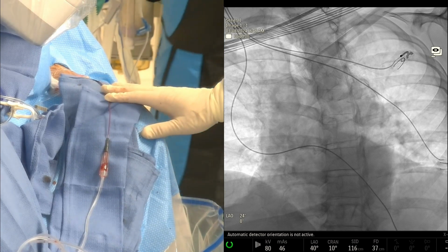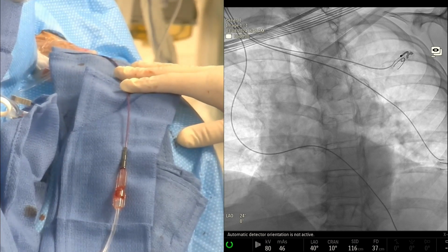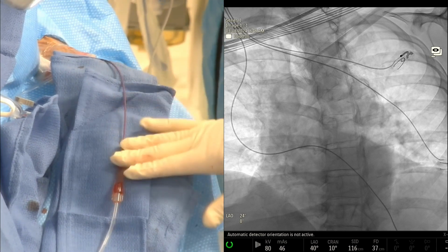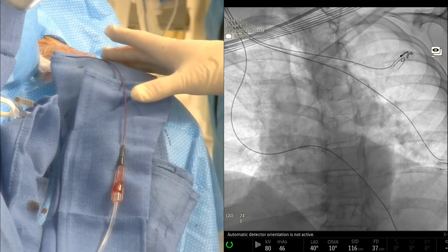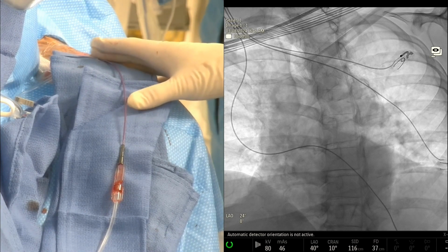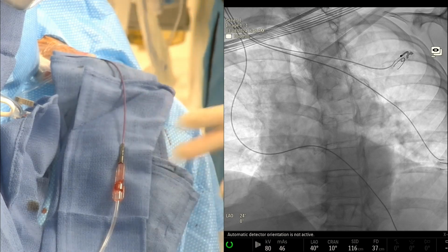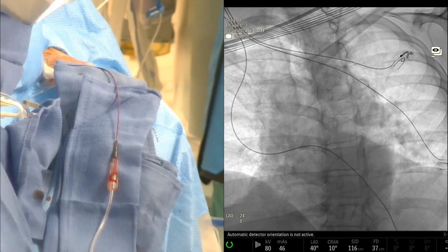This diagnostic catheter that we have in here is a 130 centimeter Penumbra Berenstein tip. And this is a nice catheter, 0.040 lumen. But what I like about this for radial access is it's 130 centimeters. So this gives us a few extra centimeters to get to the target vessel. We're actually hooked up to the power injector right now, but we haven't done the angio yet.